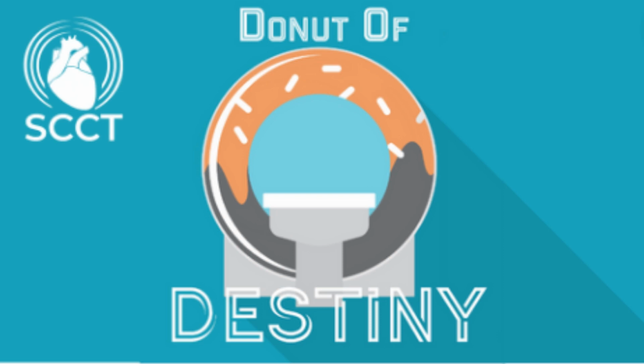Interesting. Charley, so what's the clinical implication of having a high volume to mass ratio versus a low V to M ratio? Yeah, and it's very interesting because I would say in all of the data that we've looked at, if you have a high volume to mass ratio, even just above the median, it is very, very uncommon to find a positive FFR value less than 0.8 unless you have very significant stenosis. And so, for instance, you might not see a positive FFR or FFRCT in a high volume to mass patient unless you have perhaps a 60 or 70% stenosis in a main vessel.